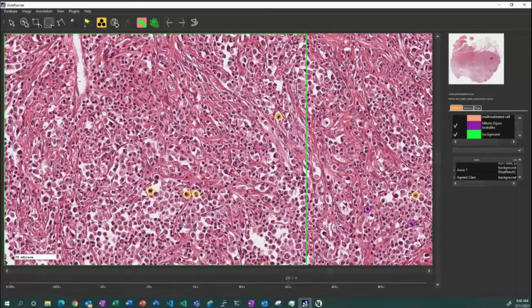And if you remember that slide I gave you about the structure of a whole slide image, that base layer of the pyramid is what we'll extract the tiles from in our pipeline. So our goal is to create patches of a set dimension. In our case, we're going to do 512 by 512 and create a batch of patches to feed into our model.